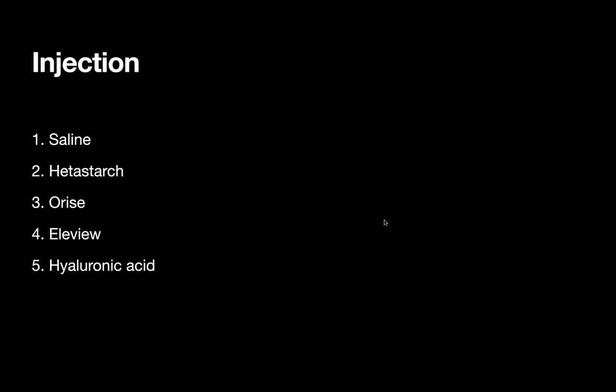So once you decide that you're going to do endoscopic mucosal resection, what solution would you like to use? Would you like to use saline, Hetastarch, Orise, Eleview, or hyaluronic acid?